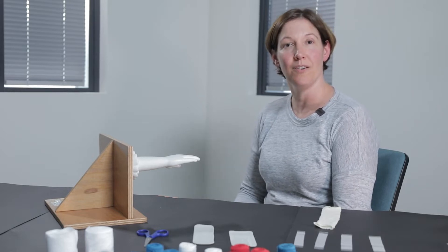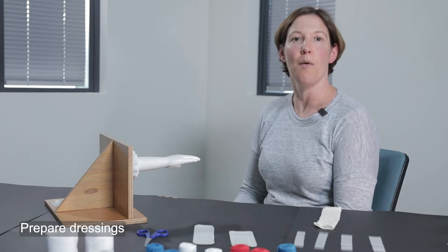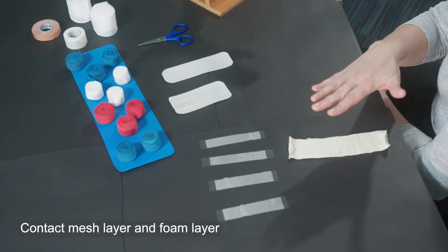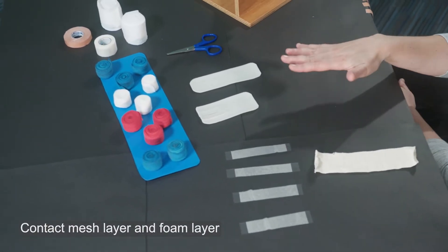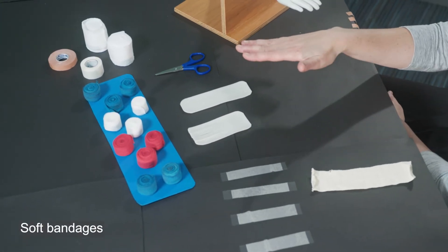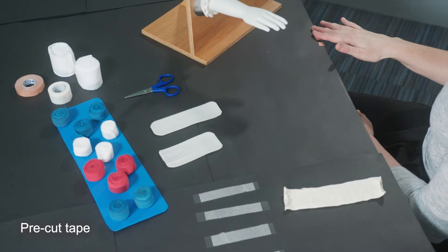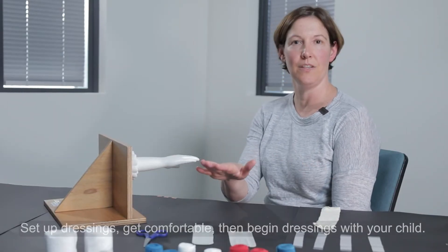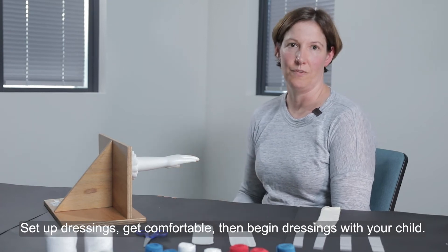It's really important before you start your hand wrapping techniques to have all of the products that you require prepared. Today I have some contact layers if you're managing blisters and wounds, as well as all of my soft bandages, scissors, and some pre-cut tape. Before you get your child to sit down with you, please get everything ready and sit in a comfortable position before you invite your child over to get started.